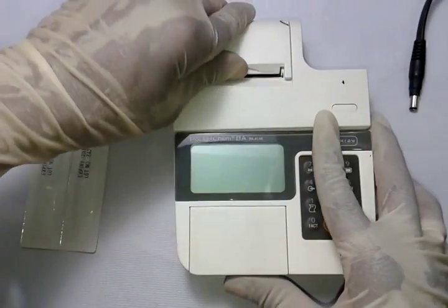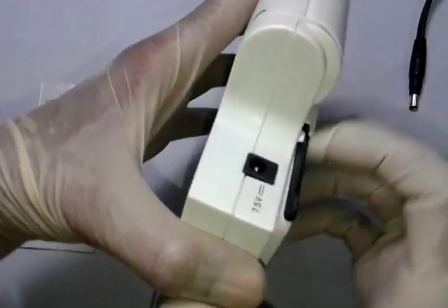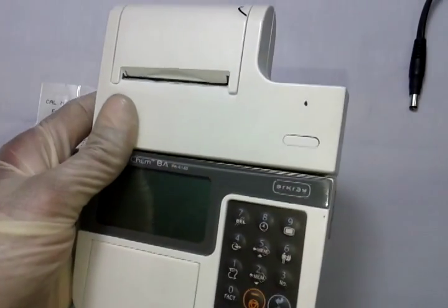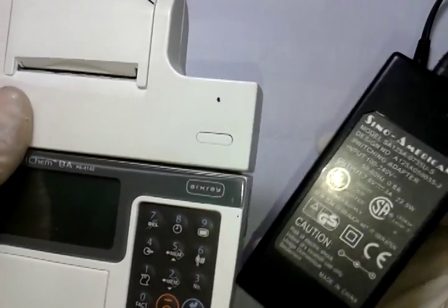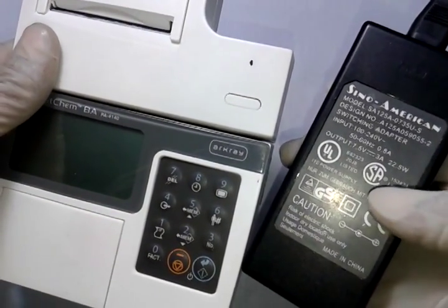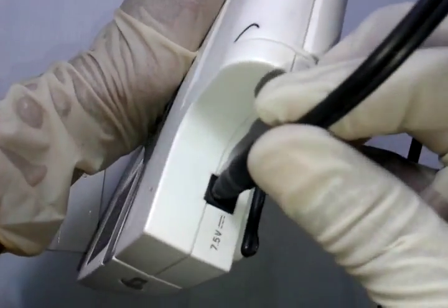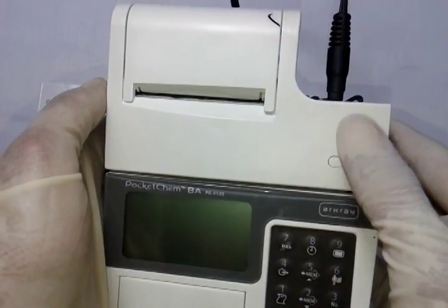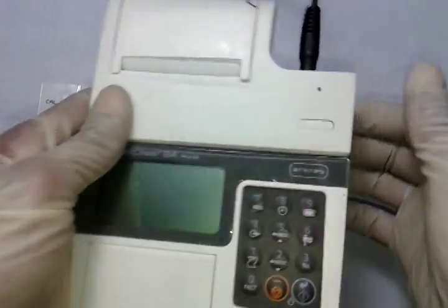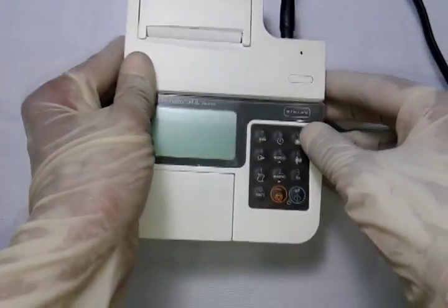The instrument is built-in with a thermal paper printer. At the back side there is a port for the power supply, which takes only 7.5 volts. An adapter is provided with the instrument, also rated at 7.5 volts. There is also a paper feed button — pressing it confirms the power supply is connected and the paper is working.